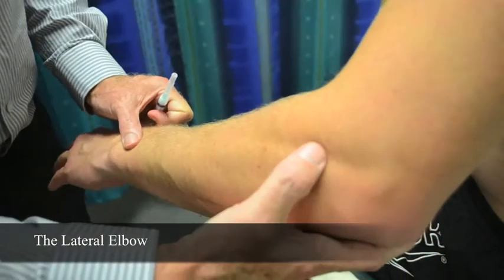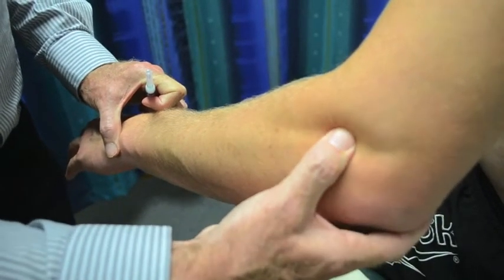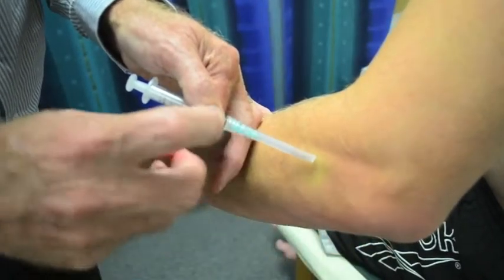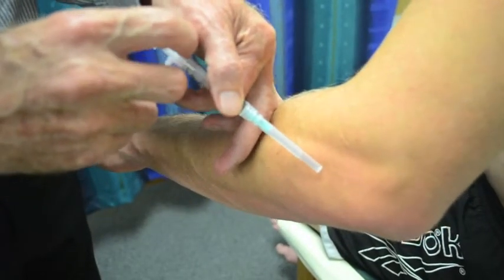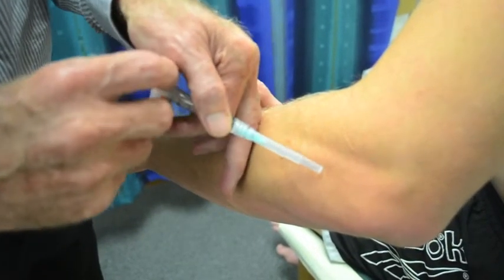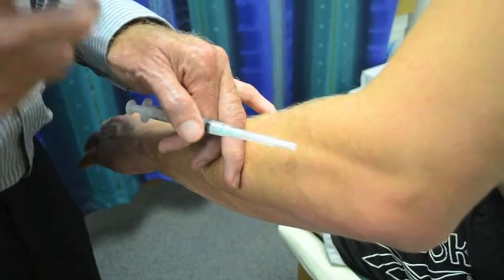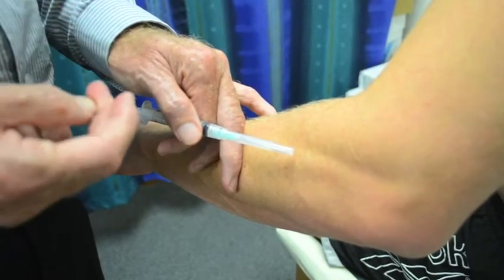The second site is the lateral elbow. Localise the structure of the lateral epicondyle carefully, coming down distally a couple of centimetres and injecting at the appropriate angle. Starting deeply with the injectate and then pepper-potting around the area — angling the needle, progressively pulling back and withdrawing a little bit and repeating the process — so that the two mils of injectate is divided up into multiple small aliquots rather than one large volume going in one spot. Otherwise it will distend the tissue and be quite painful for the patient.